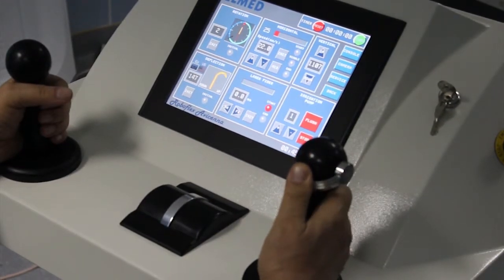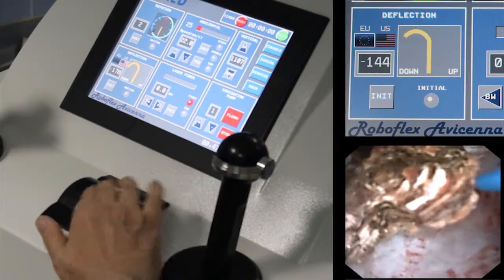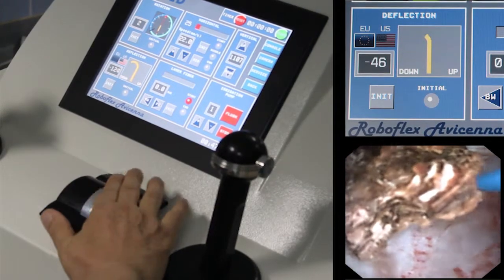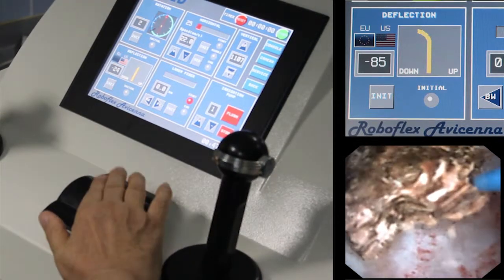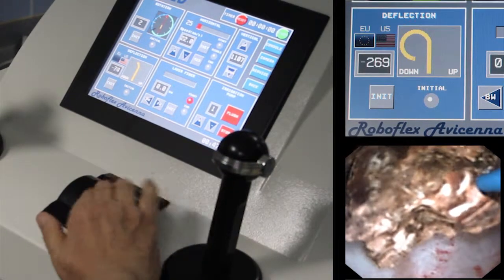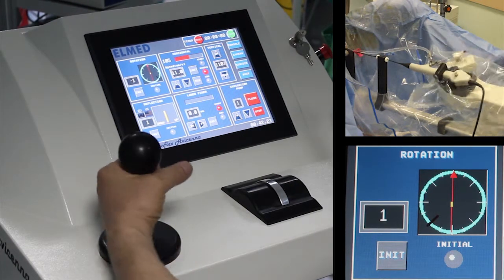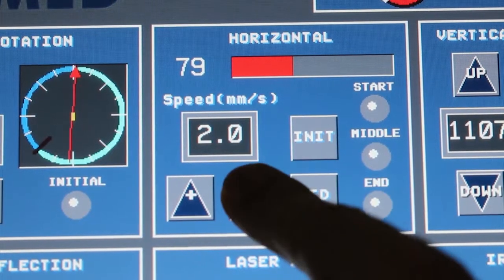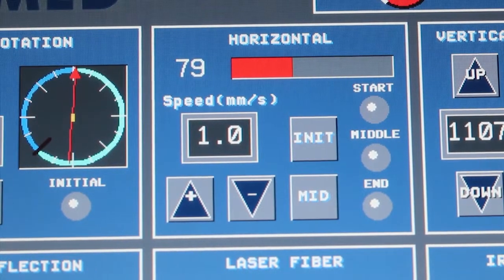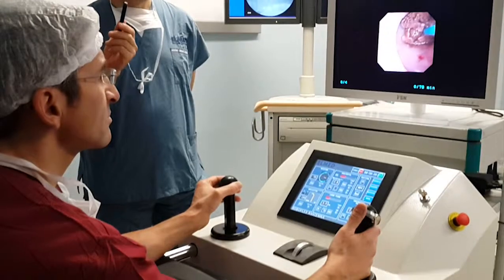Micromotors move the steering lever of the handpiece. For fine adjustments of deflection, a central wheel can be used, especially during precise systematic ablation of the stone. The left joystick allows for rotation of the endoscope, as well as advancing and retracting the scope. The speed of rotation and advancement can be regulated on the screen of the console.